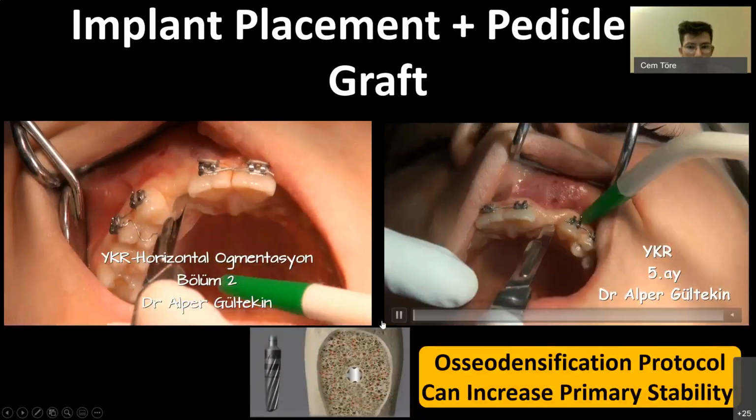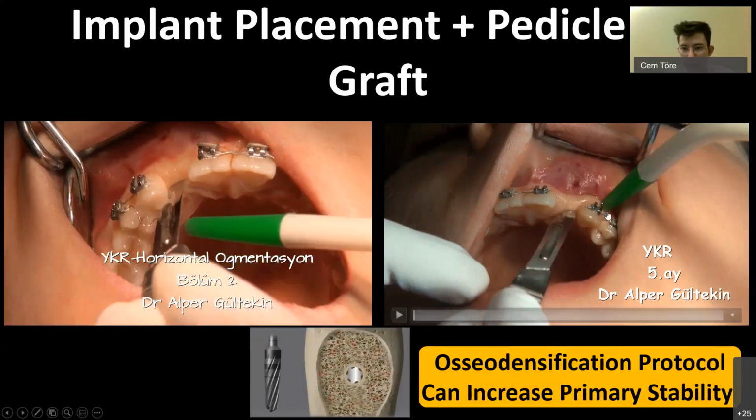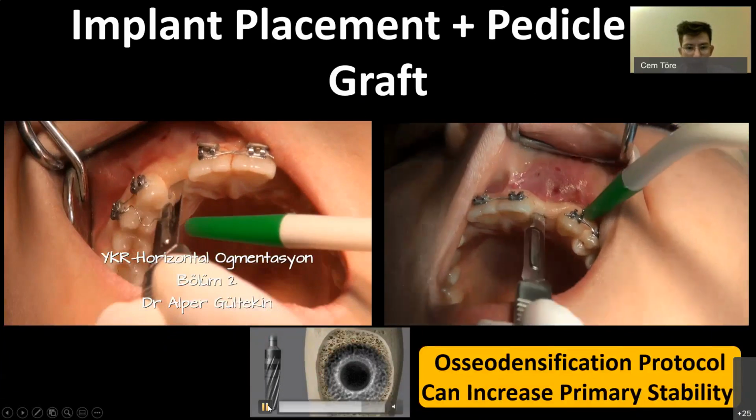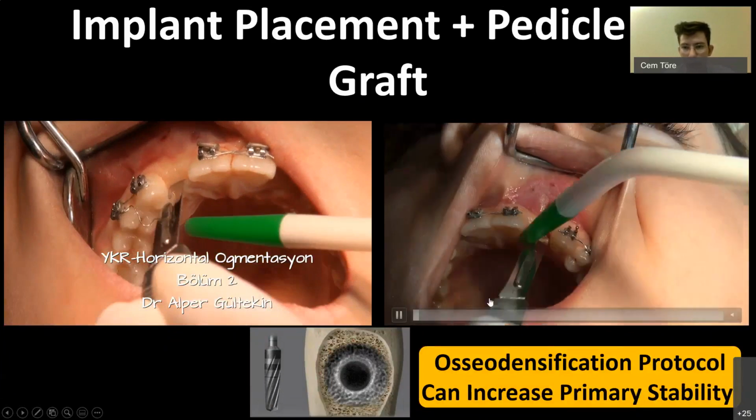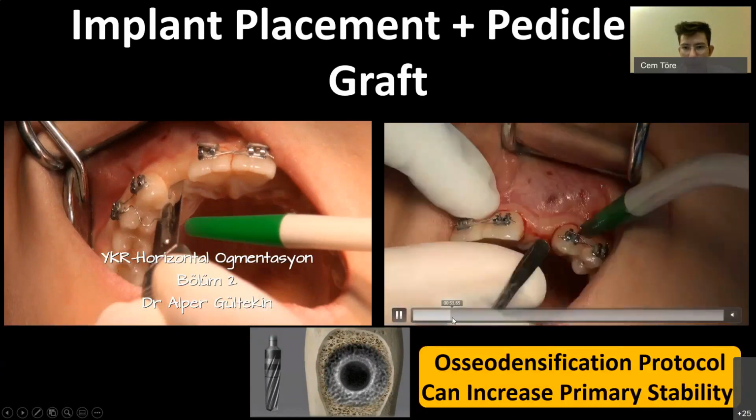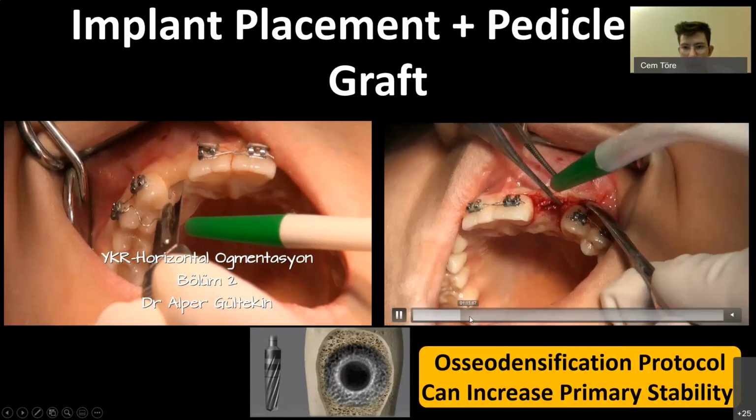And now we are going in to retrieve the area and place implants. We will be using the osseodensification protocol as well. Here's our incision, vertical incisions, flap elevation.